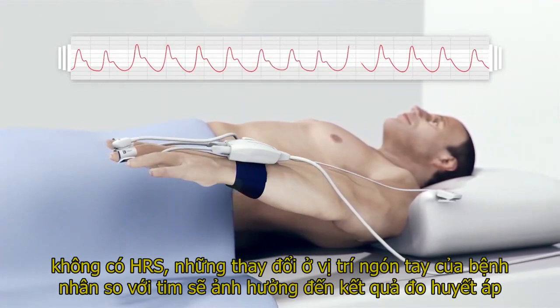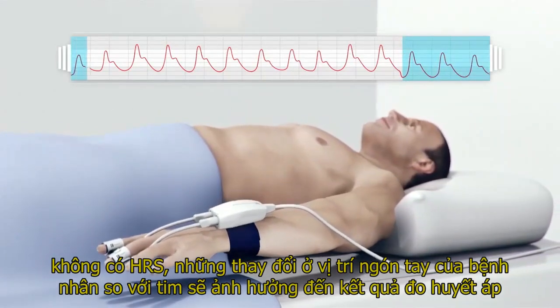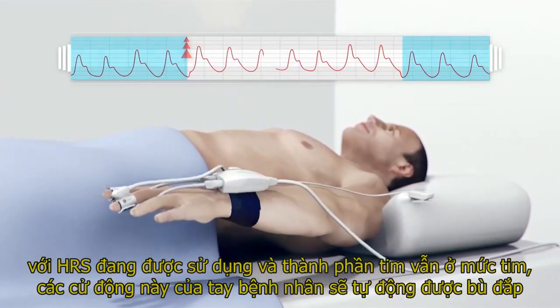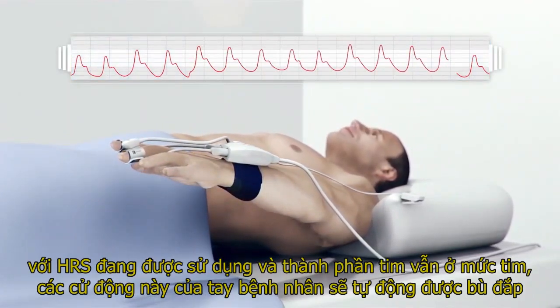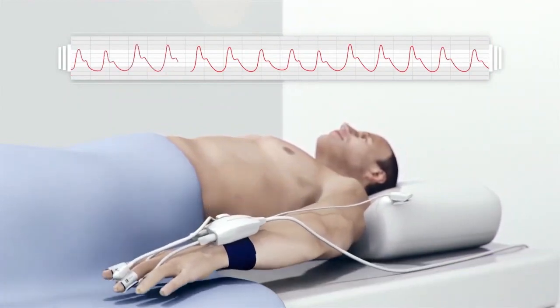Without the EVHRS, changes in the patient's finger position relative to the heart will affect the blood pressure measurements. With the EVHRS in use and the heart component remaining at the heart level, these movements of the patient's hand are automatically compensated for and will not affect the blood pressure measurements.